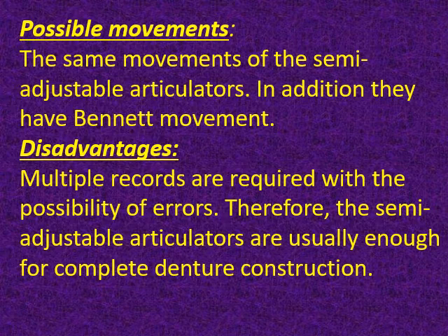Disadvantages: all these advantages and improvements in the articulator also have a disadvantage for complete denture construction, because a large record or multiple number of records are required, which is possibly a source of error. Therefore, the semi-adjustable articulators are usually enough for complete denture construction.